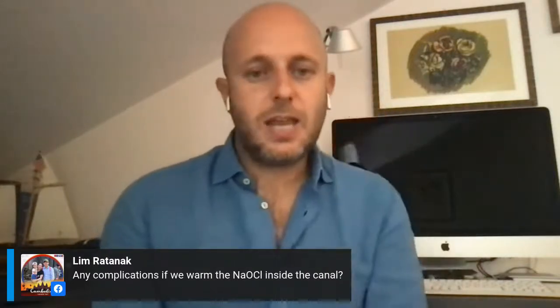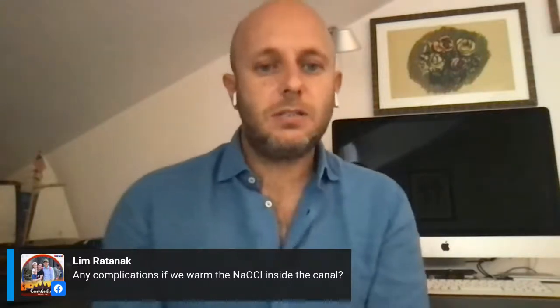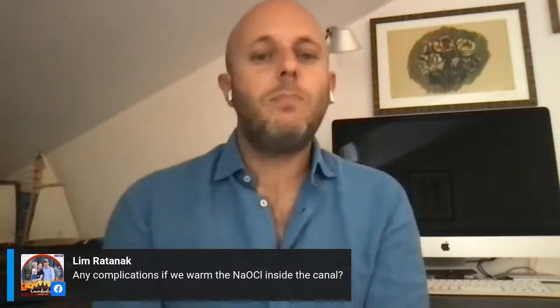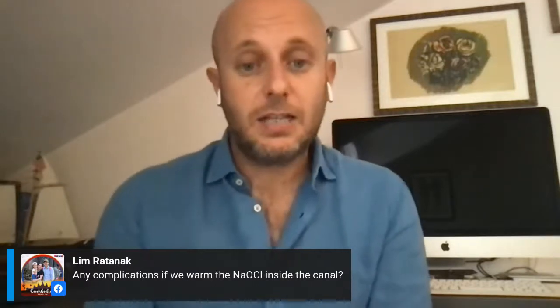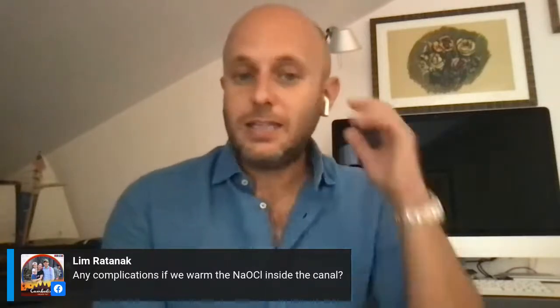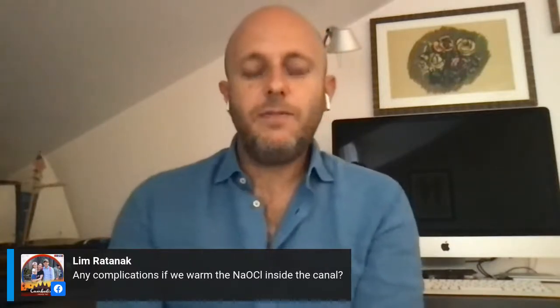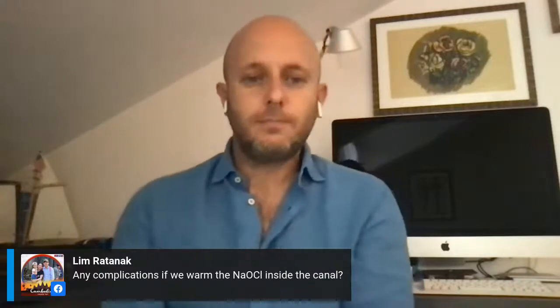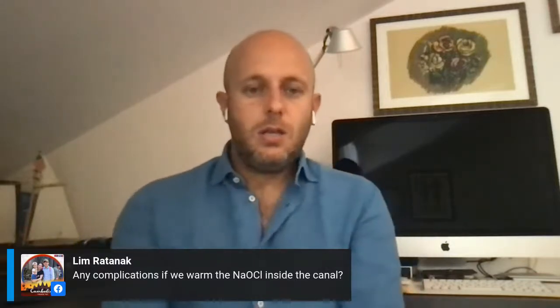Honestly, I prefer to warm it, if possible, for less than 6 seconds. In the video I showed you, you can see that in many cases, in 2 or 3 seconds, the irrigating solution boils. As soon as it boils, I stop warming it inside the canal. And honestly, I'm using this technique. I started to use this technique more than 6 or 7 years ago, and never had any kind of complications. So I think that if we respect the protocols, we can work daily in a safe way. Another question.